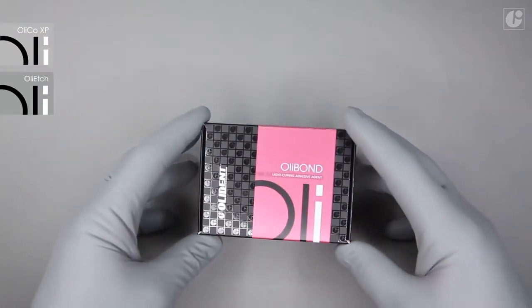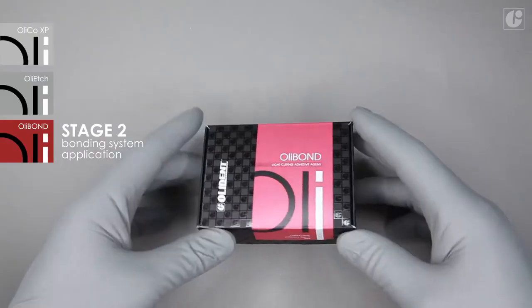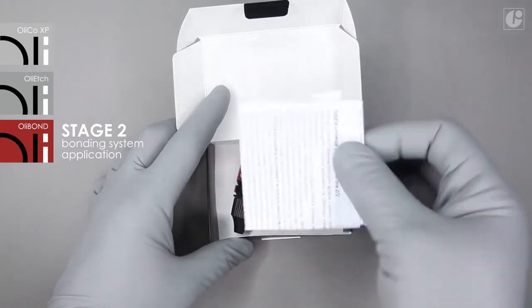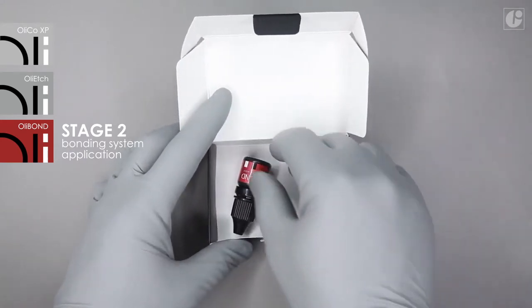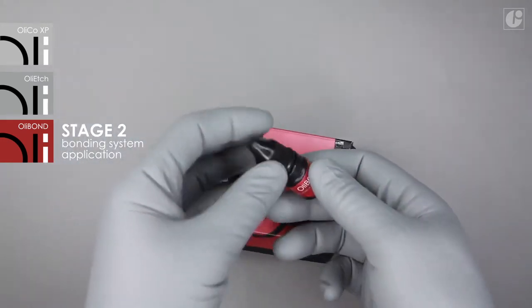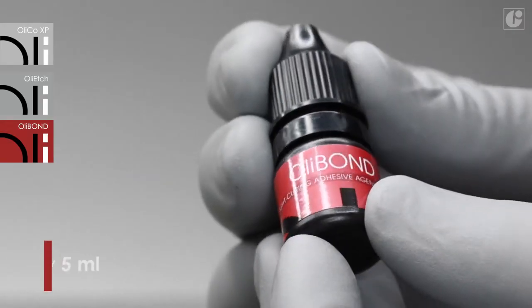OliBond is a primer-bond type light-curing bonding system. Owing to its exceptional hydrophilic properties, it works great in wet bonding applications, allowing resin monomers to penetrate deeply into dentinal tubules. This ensures a strong and above all durable bond between the composite material and dental tissues.